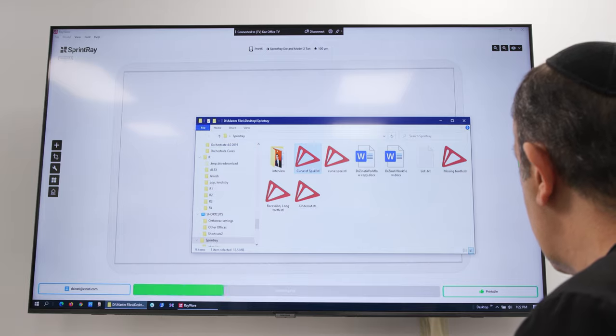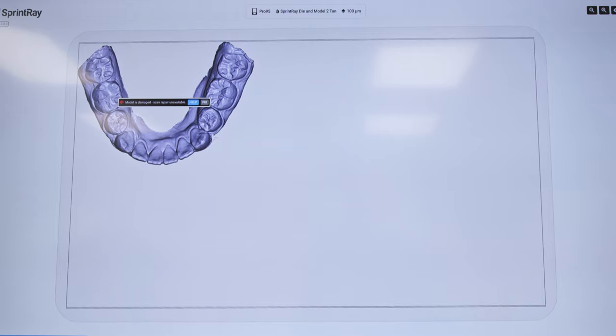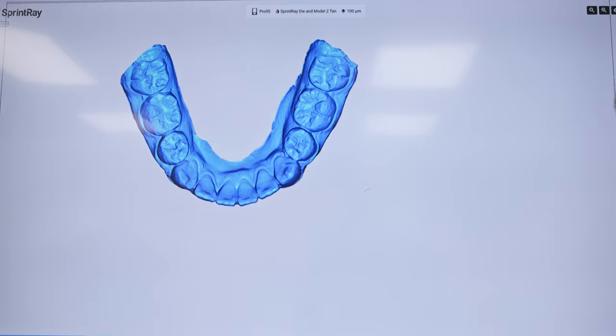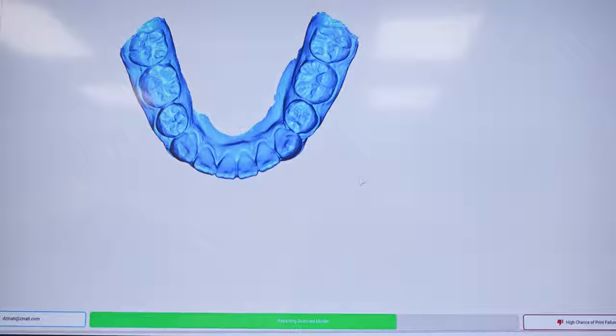We're going to take our STL file and drop it onto the build platform. We're going to make a base by clicking on fix. This model happens to have a curve of Spee which I want to get rid of, and I'm going to show you how and why.